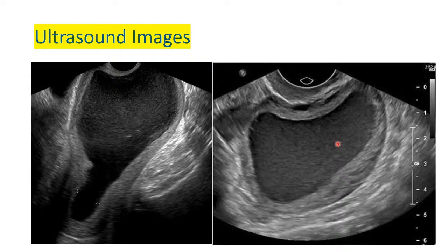How do you report this case? So reporting is fundamental. It is key, it is the language that we use to communicate with someone who is not present. The referring clinician is not with you when you are doing the sonar. So how do you communicate your findings? That is the fundamental part of every ultrasound scan.